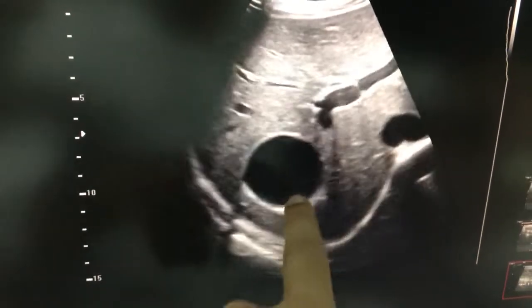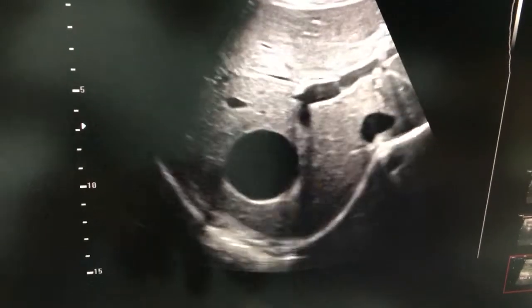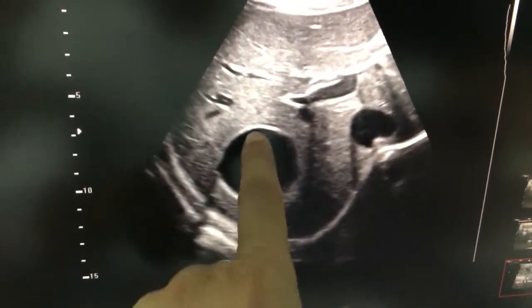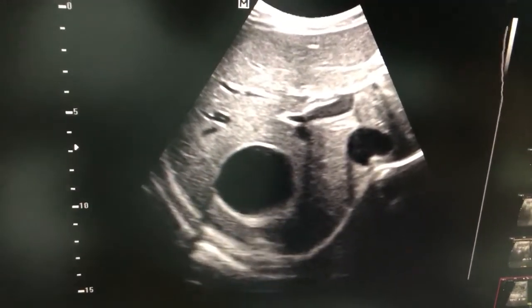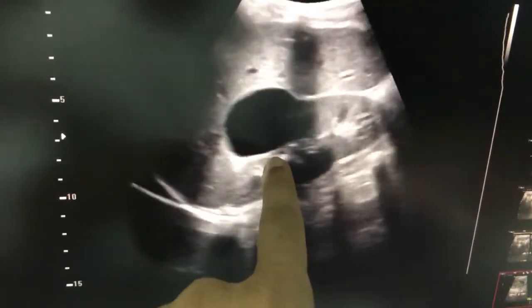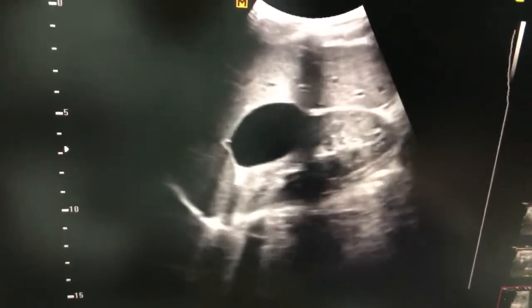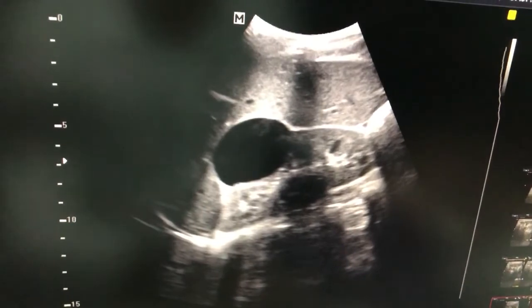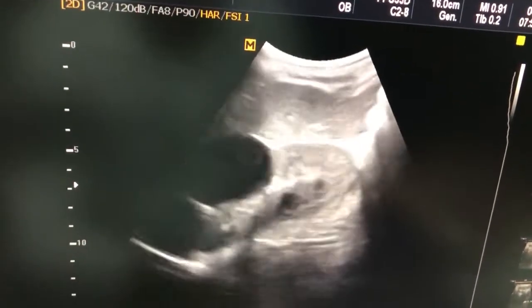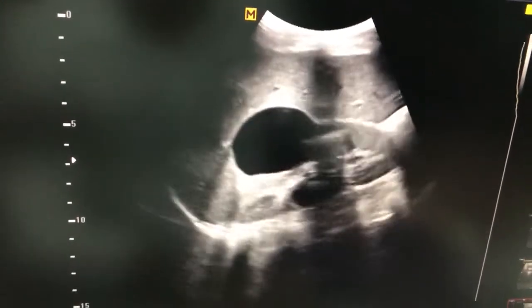Now this is the case of renal cysts. Whenever you see this kind of cyst or mass in the right lobe of liver, especially here or in the lower part, you just confirm it from the lateral view that the cyst which was seen in the liver — assumed in the liver — is a cortical cyst in the right kidney. This is a cortical cyst and it is not in the liver.